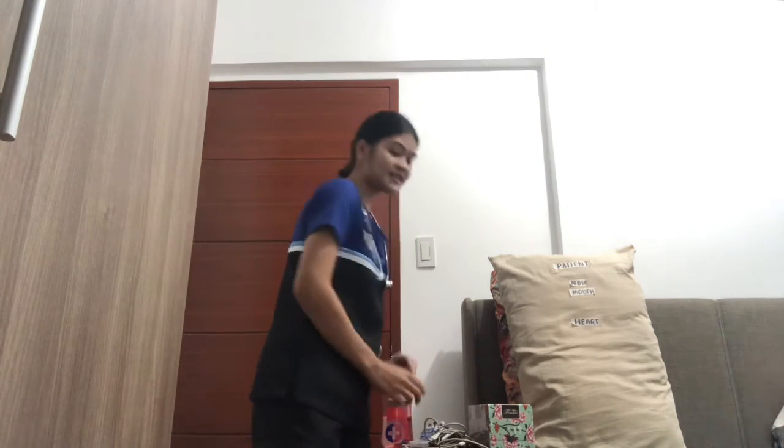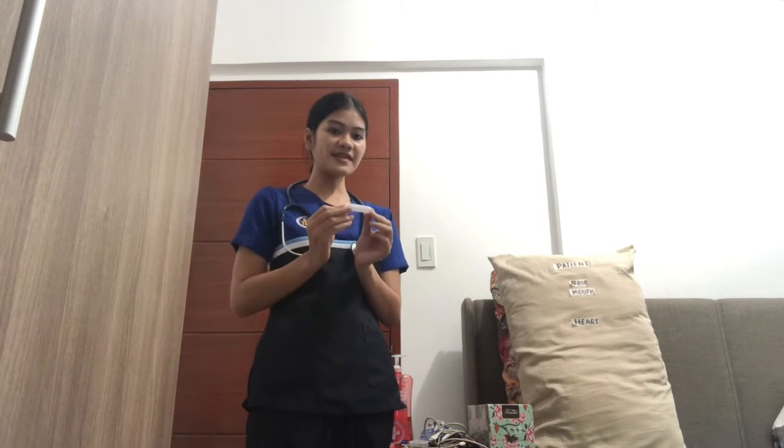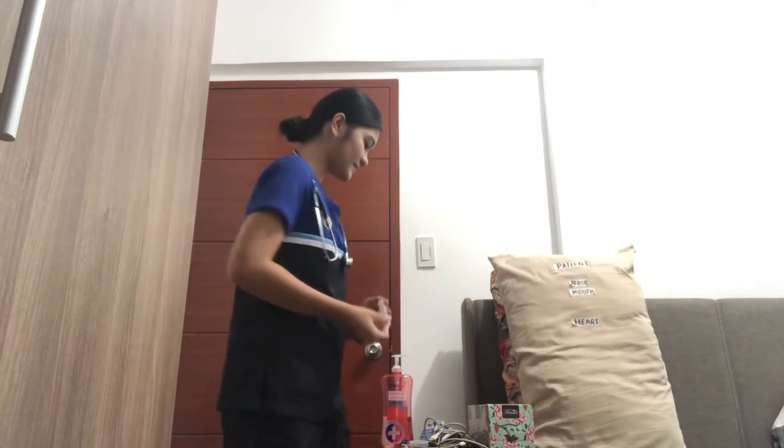And lastly, the medication as per doctor's order. So again, before bringing it to the bedside, we should check if the medication is right and the expiration date is current. Since again, the medication I prepared is right and the expiration date is current.